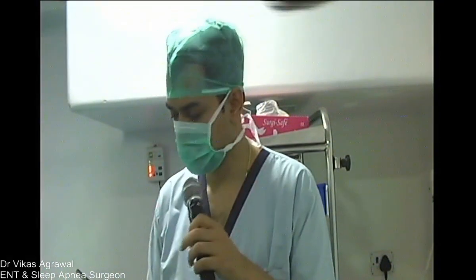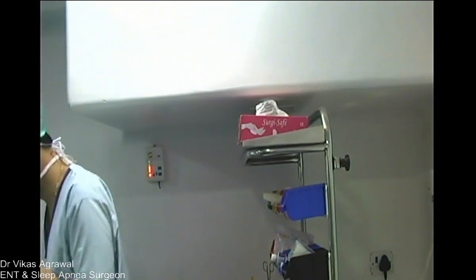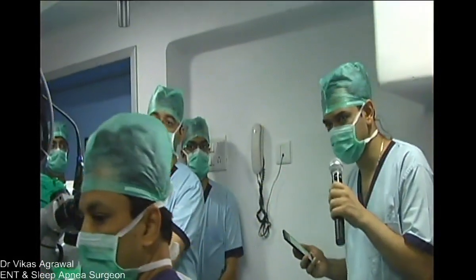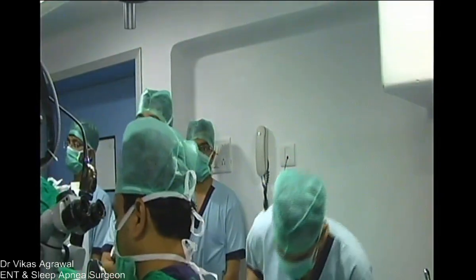Yeah. Can you just now switch? Yeah, so I'll just let Dr. Vikas continue. I'll intermittently take questions and we'll be answering them. Okay, so can we change the camera to the microscopic picture now?